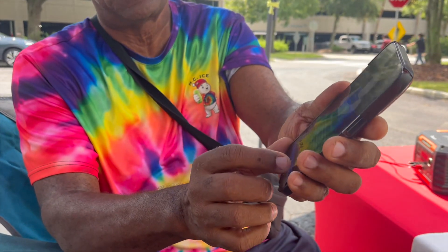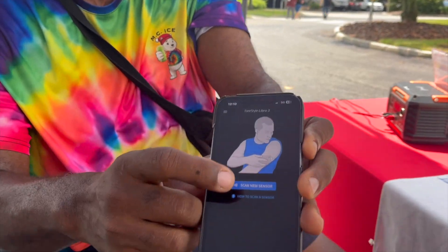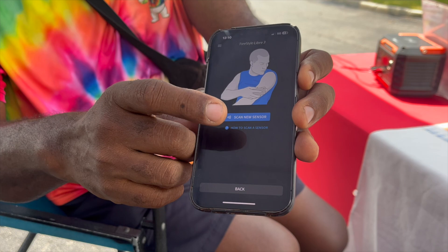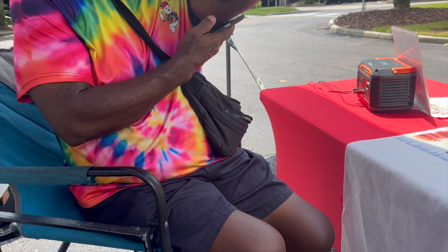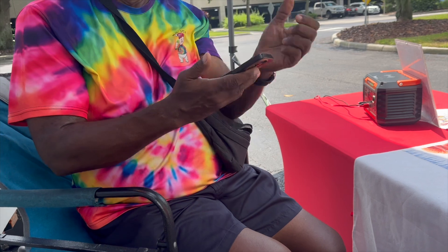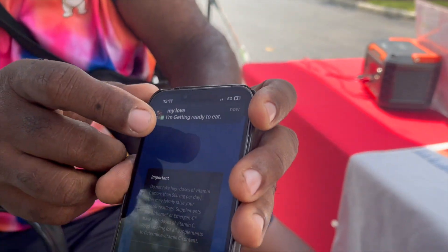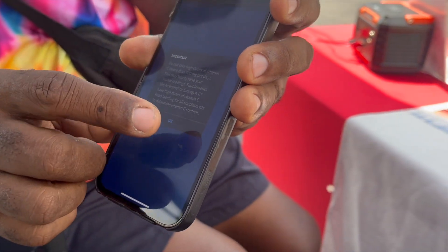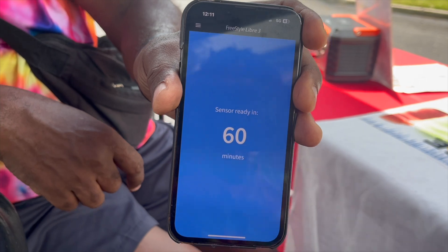All right, so I'm going to sync up my sensor now. You get to the screen, it'll tell you to hit next. Then you tell it to scan for a new sensor, and you hold it near your arm so it picks up the sensor. Then you've got to wait 60 minutes — after that 60 minutes you'll get your blood glucose readings.